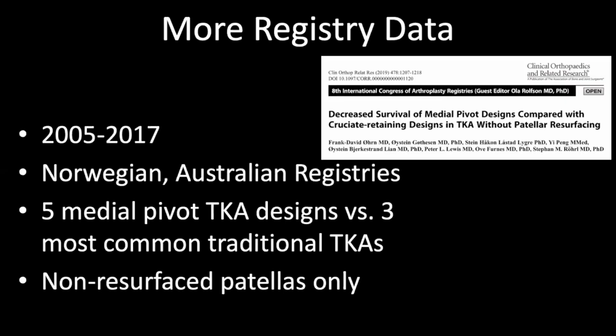Now, another study that looked at registry data was done looking at the Norwegian and Australian registries from 2005 to 2017, and they looked at 5 medial pivot total knee arthroplasty designs versus 3 of the most common traditional total knee arthroplasties. They only included patients in the study that did not have resurfaced patellas.